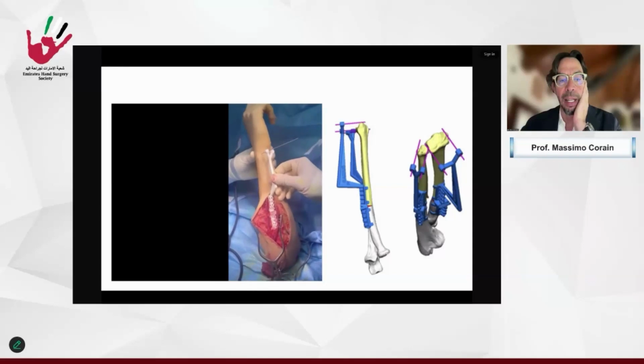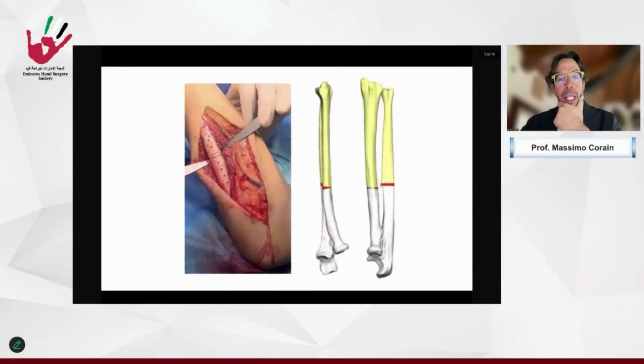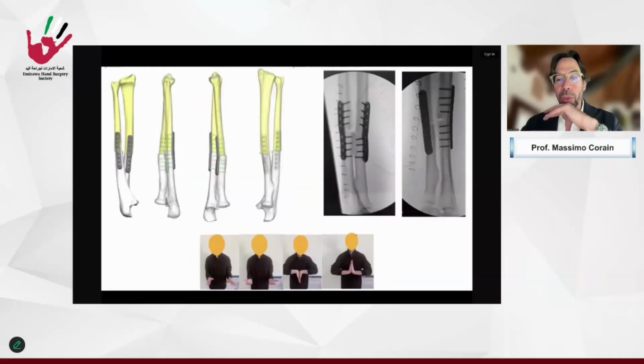For that, we have these pins for the distance to the joint. This is the osteotomy line normally done with piezo surgery to be much more precise than I can, and the hole pre-drilled. And I always suggest interosseous membrane lysis, central band lysis, to give a soft tissue restore of the movement. And this is the final check with a good 80% restoration of the pronation.